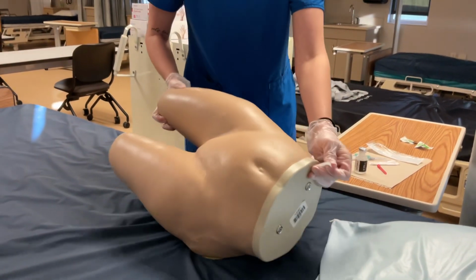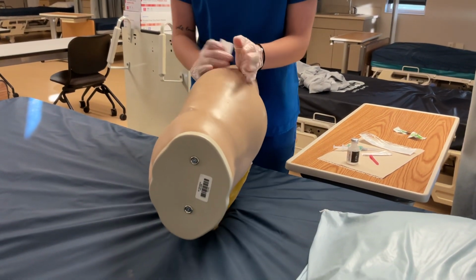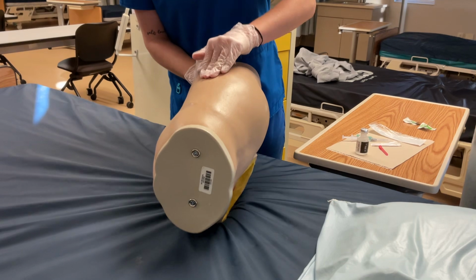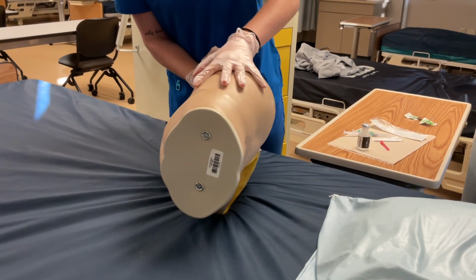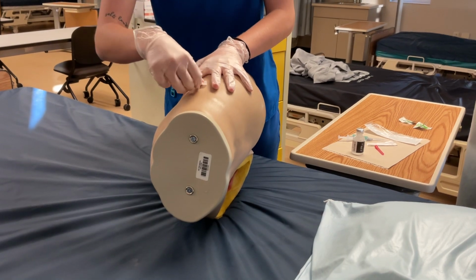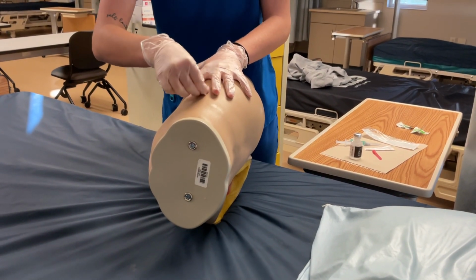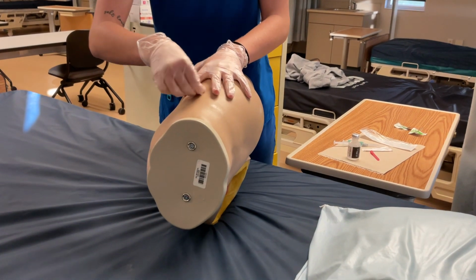I am going to just find where I'm going to be giving the shot. I would hold the skin taut, so pull the skin back. I would go in a circular motion for 30 seconds.